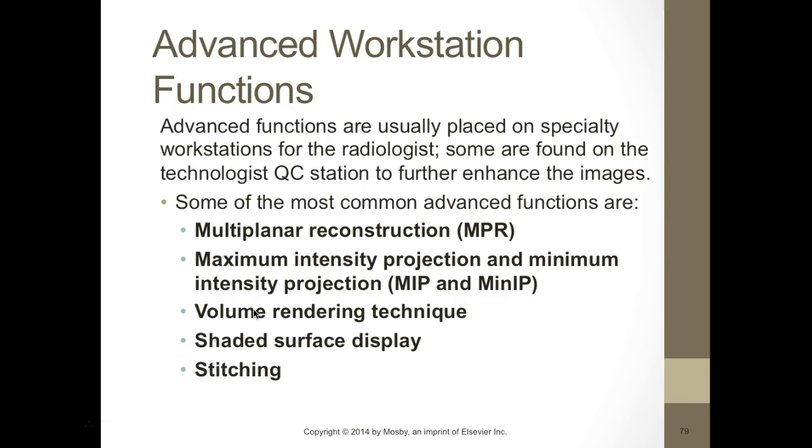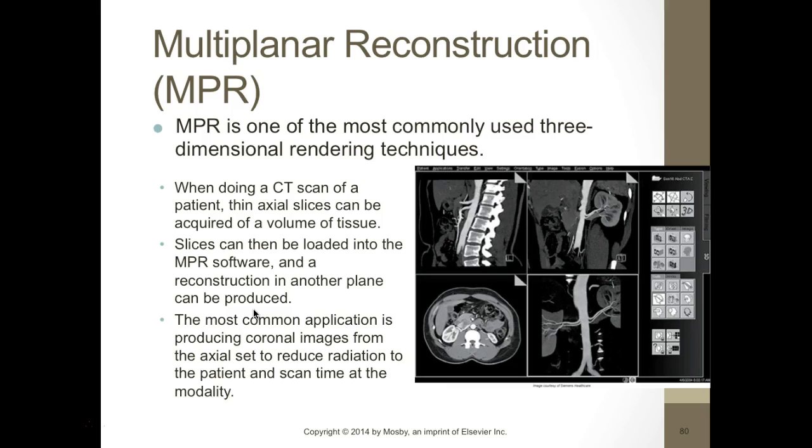So there's usually on a specialty workstation or the radiologist workstation. QC stations sometimes have them. So there's the MPR, which is the multiplanar reconstruction, the MIPs, which is the maximum intensity projection or the minimum intensity projection. There's a volume rendering technique, and there's shaded surface display or stitching.